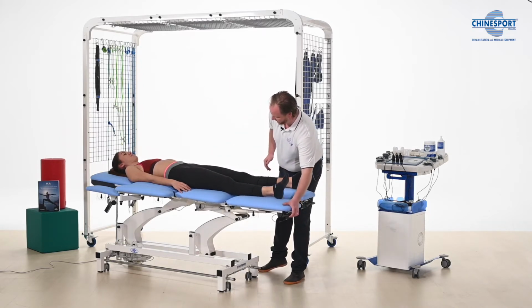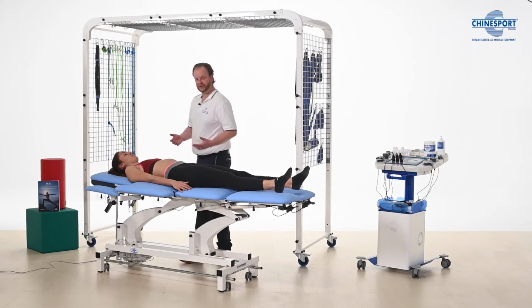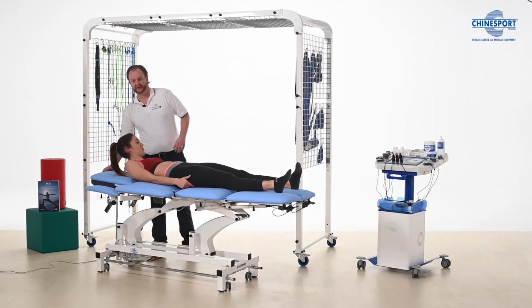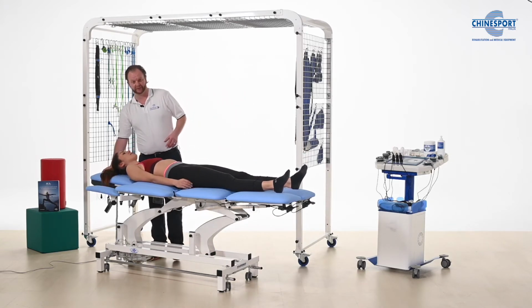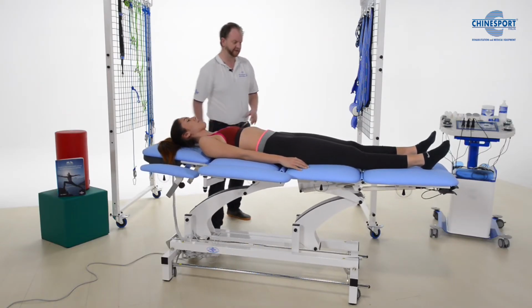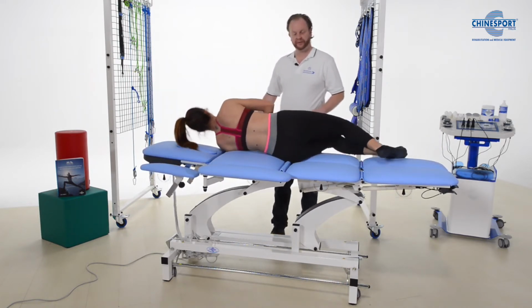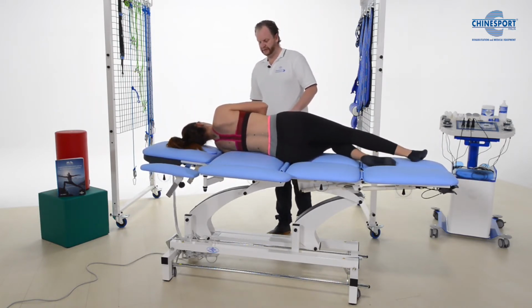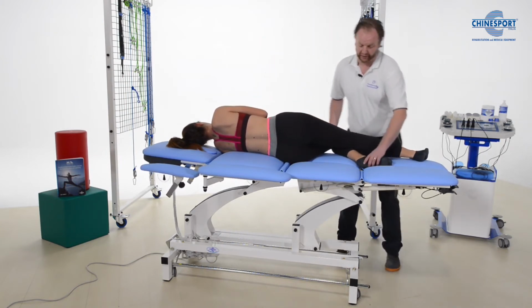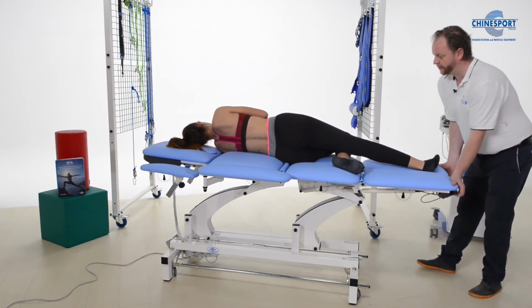Okay, perfect. Okay, so we can use the table also to do isometric exercises and contractions, and we can do some activation exercises as well. If you can lie on your side now, for example, if we want to do some mobilizations or another stretch, for example, for the quadratus lumborum muscle, we can go here.